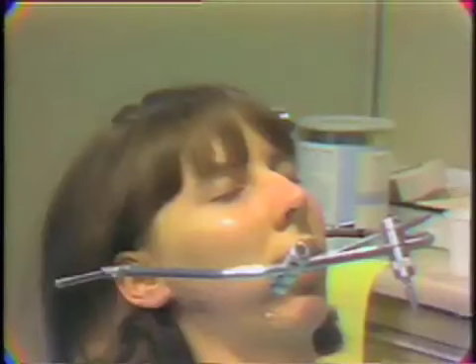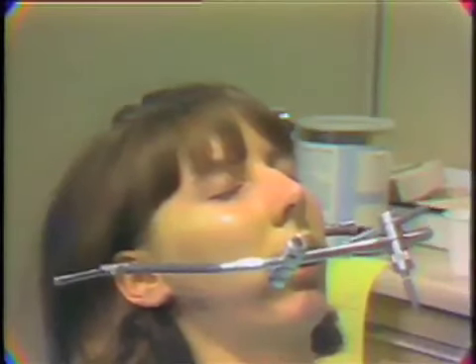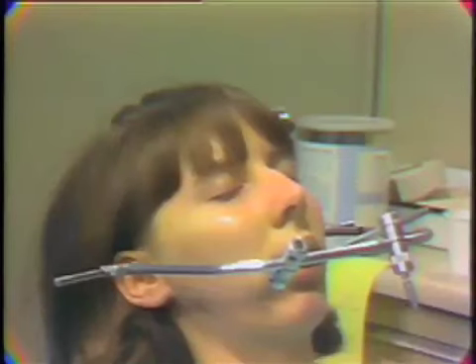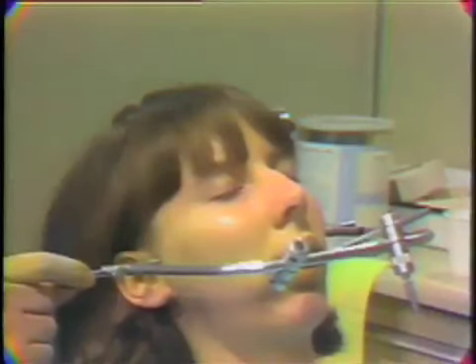The facebow transfer utilizes the terminal hinge axis to transfer the maxillary cast to the articulator so that it's in the same relationship to the condylar axis on the articulator as it was to the condylar axis on the patient's head. So we center the styluses, or the styli, over the hinge axis point, and we transfer this point from the patient to the articulator.